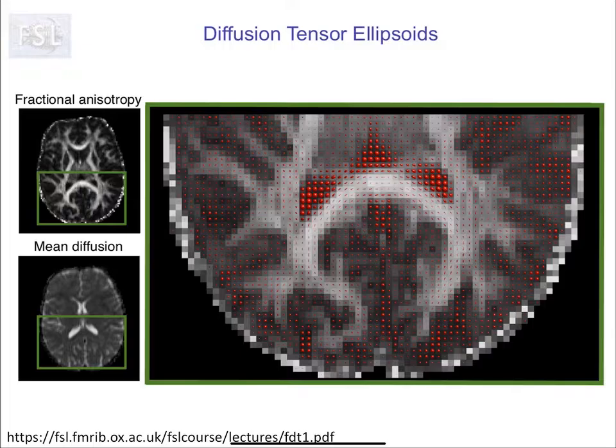So as we talked about last time, at least for the very standard DTI protocols, what we're trying to estimate is the shapes of these diffusion tensors. Okay, and especially in white matter, they're very anisotropic. They have a principal direction that's very clear that follows the direction of diffusion. And then in areas like gray matter and CSF, you have much higher diffusivity and much more isotropic diffusion. And so there, the diffusion tensors are represented by spheres.